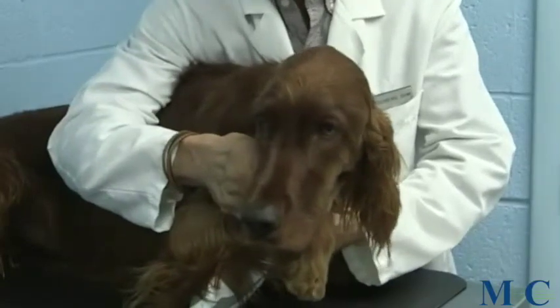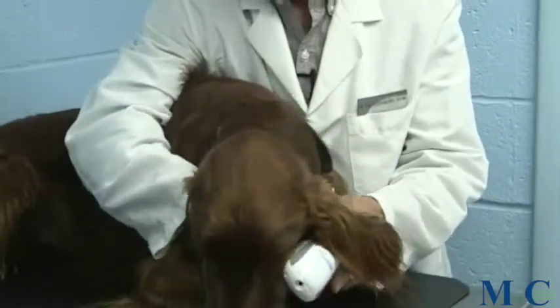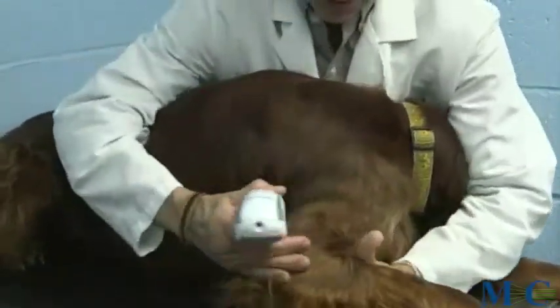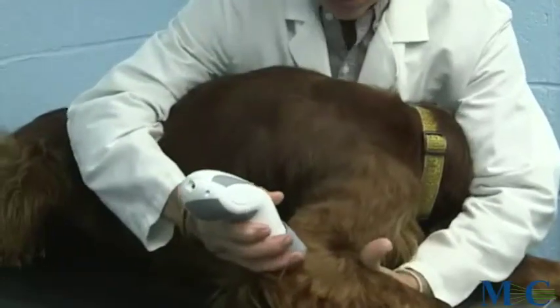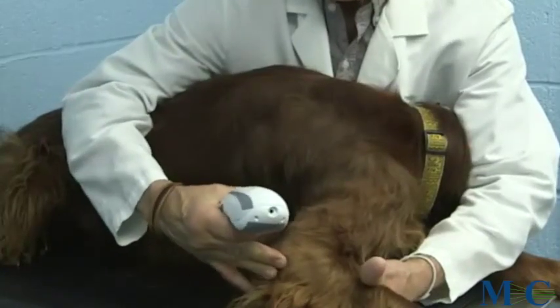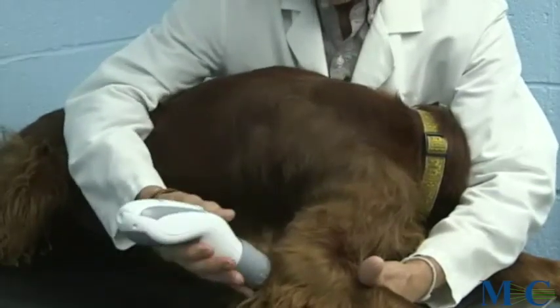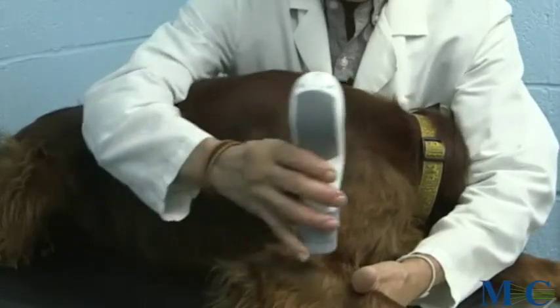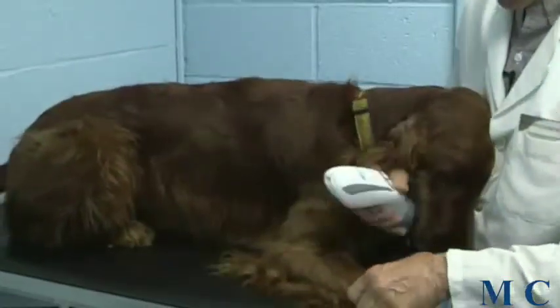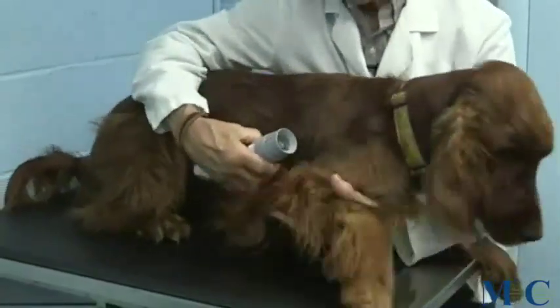The next area we would treat is the affected area itself — in his case, if we're talking about the elbow, we're going to treat outside the elbow, or laterally over his elbow. If he's a bigger dog, it may take a couple of placements. If I palpate and find the problem is specifically in the posterior area of his elbow, I may just treat posteriorly. On the other hand, if it's toward the anterior or front of the elbow, I may have a second placement there as well. We would also come to the inside of the elbow to make sure we get all the joint surfaces, since we're now treating target tissue.